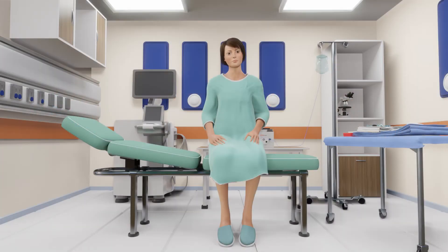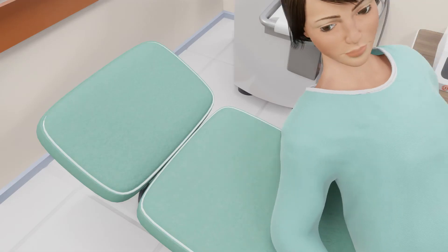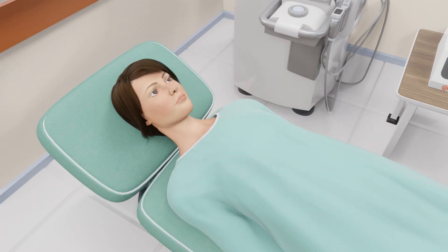You will be fully awake during the procedure. However, some patients may be given medicine to help relax. You will then lie down comfortably on the procedure table with your neck extended slightly.